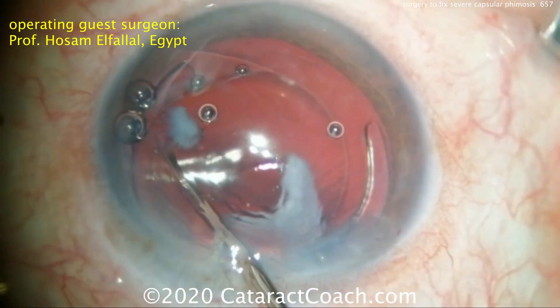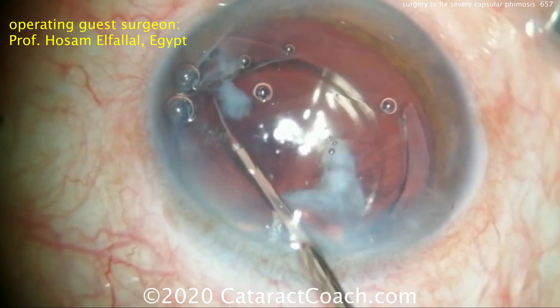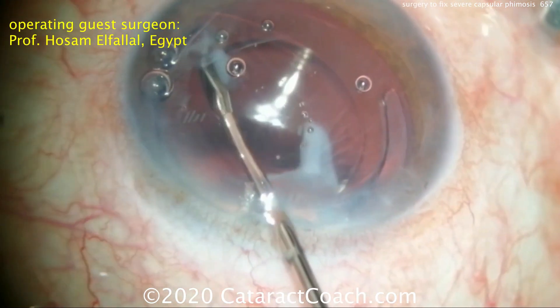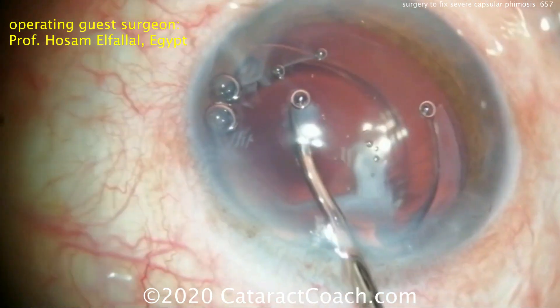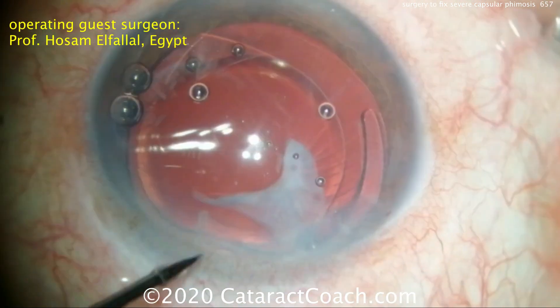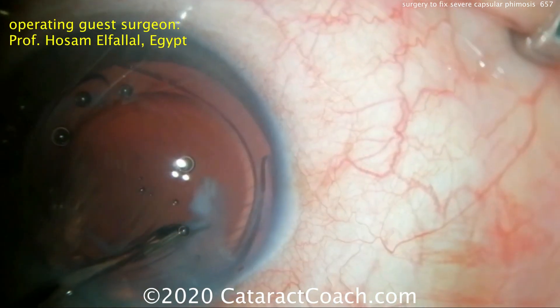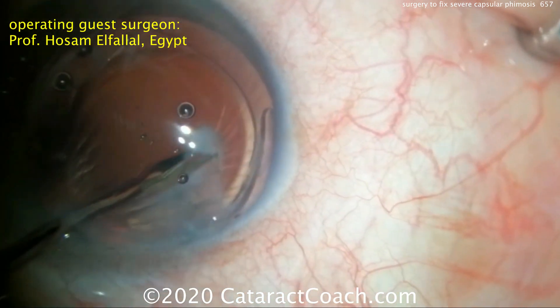Sitting superiorly, you can see just under the incision at the bottom of the screen there's a little bit more phimotic membrane. That can be removed as well, or we can even leave some of it behind. Remember — leave enough capsule behind to give support. Removing all that opacity may be the enemy of good: if you remove too much capsule or tissue, you can lose support, and we don't want that to happen.